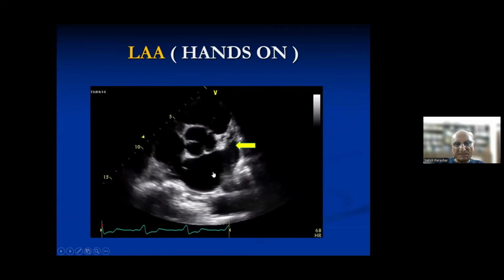This is the left atrial appendage, like a finger-like projection from the left atrium. Aorta, LA. Now this is the importance of the first two lectures of the anatomy, which I don't know if you have revised or not. LA is always behind the aorta, and goes in a finger-like projection. This is known as the left atrial appendage. And how to recall that will not be by theory, but by demonstration or hands-on.